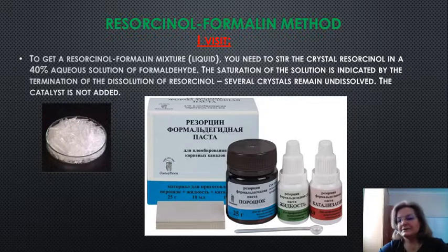The saturation of the solution is indicated by the termination of the dissolution of resorcinol. Several crystals remain undissolved. The catalyst is not added to this liquid.